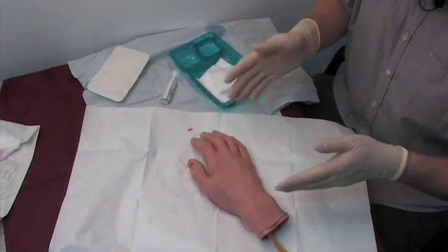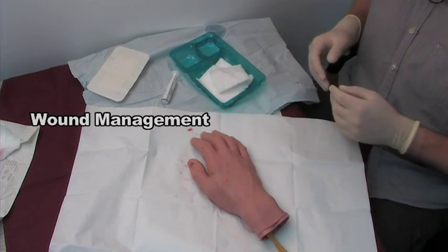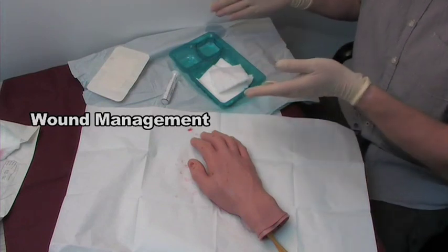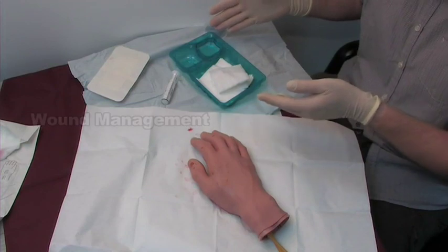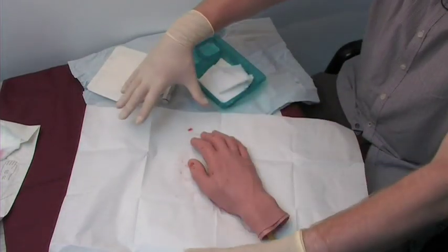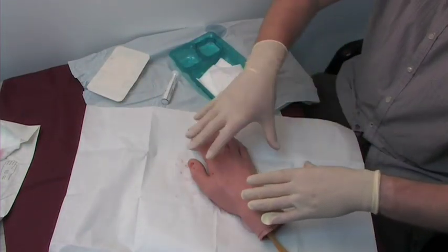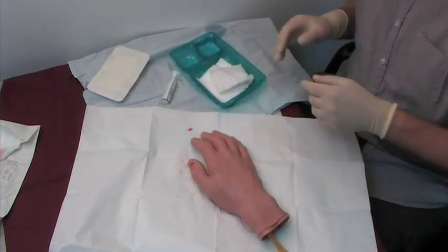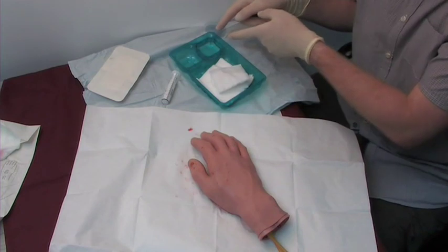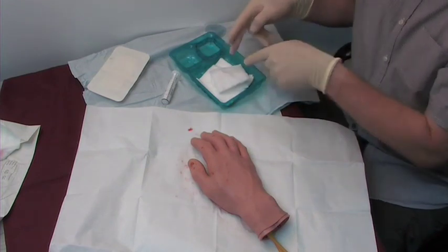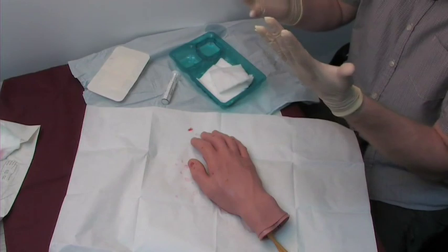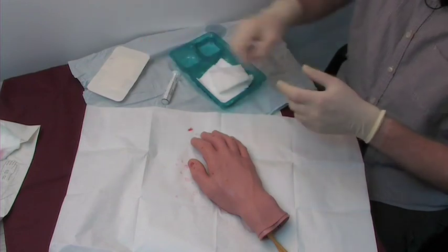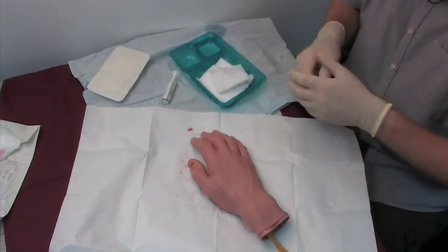We're just going to demonstrate wound management. We have our dressing pack which has been opened up using the sterile techniques which was demonstrated before. We get a drape, patient's hand is placed over it. This is my sterile field. I've got my cleaning solution which is normal saline, my gauze swabs from the dressing pack. I'm wearing my sterile gloves and I have my dressing to be applied afterwards.